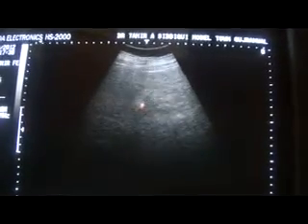And here you can see straight away that now this is the gallbladder. Why? Because at the neck, at right angle to its neck, you can see this portal vein, and this is the gallbladder. These are internal tiny calcified areas that are giving a posterior black, sharp shadow.